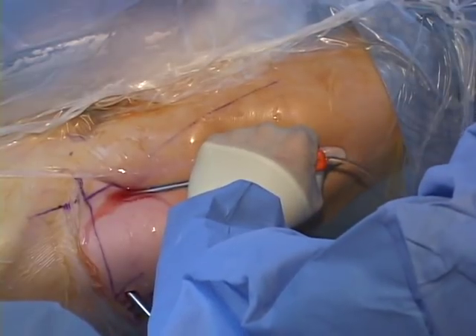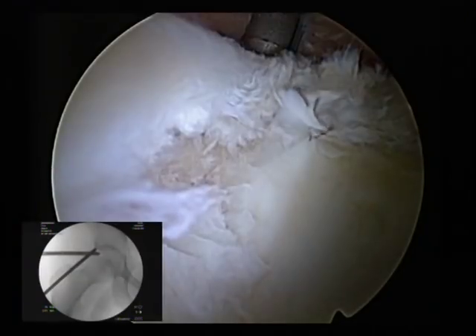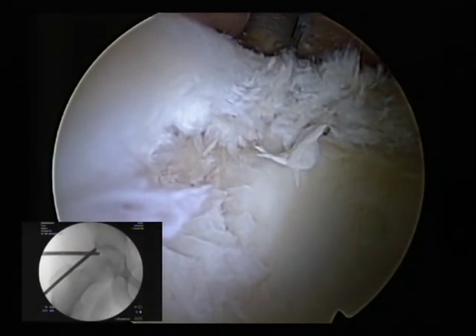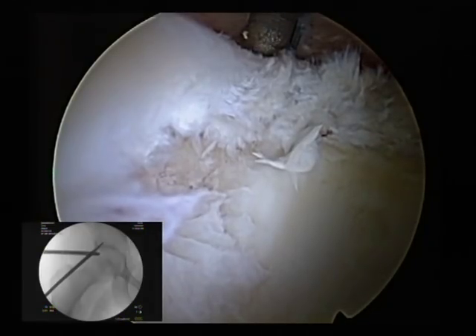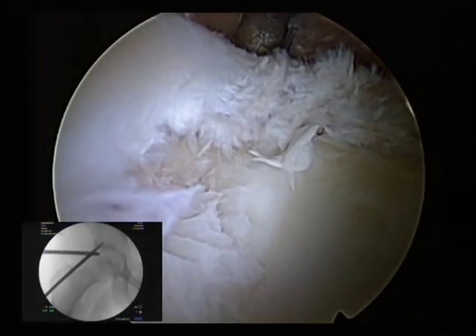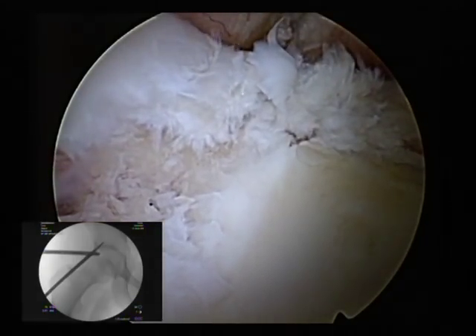Now we're going to pull the trocar out and make our drill hole. What I like to do is run the drill about halfway down and confirm that it's still divergent from the joint, and then finish my drilling. Now we've got a very, very stable hole there that I know is not going to be a problem.